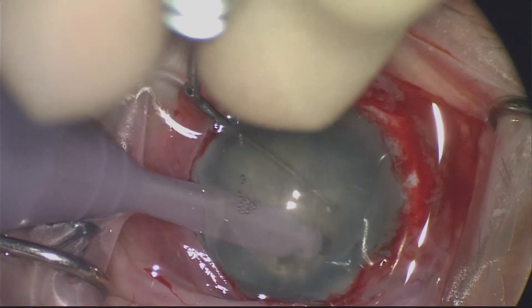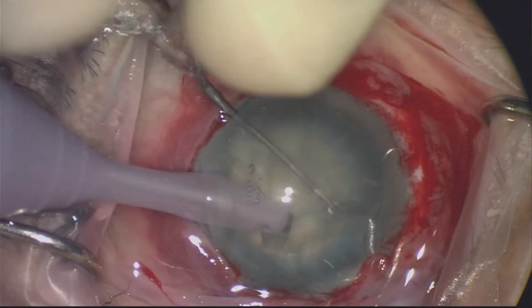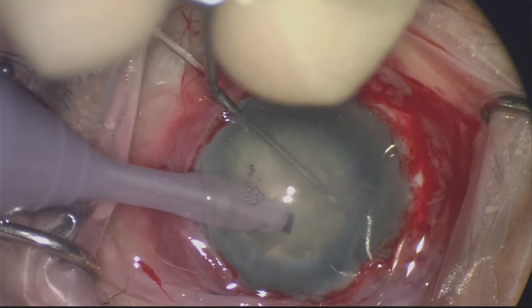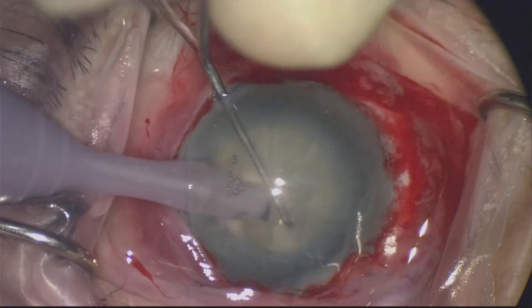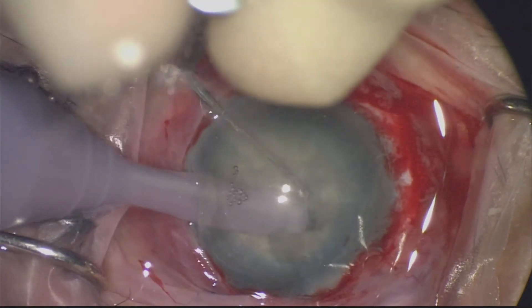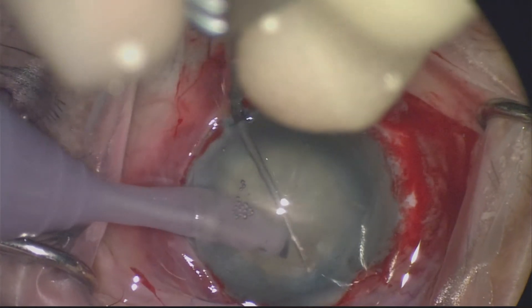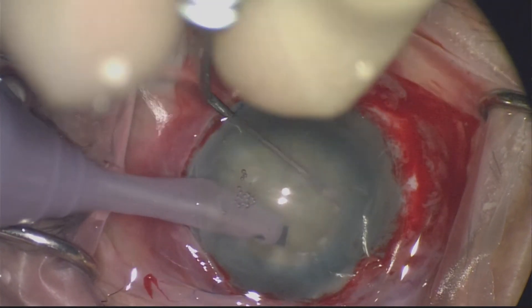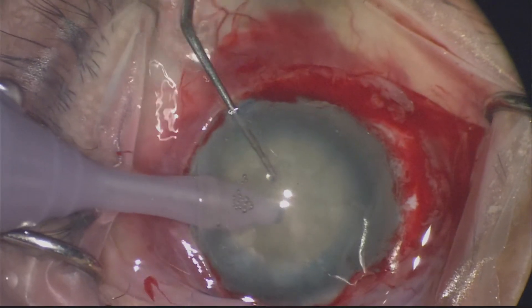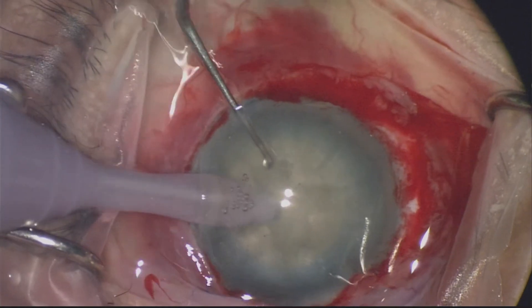In terms of breaking or splitting the lens, you want to use minimal movement within the lens capsule, try to break the lens without putting too much pressure on the capsular bag, and rotate very gently. You want to be as delicate in the eye as possible, especially in these cases.